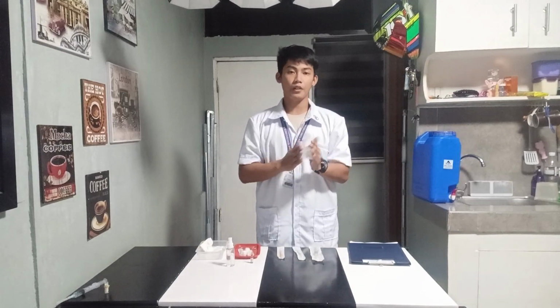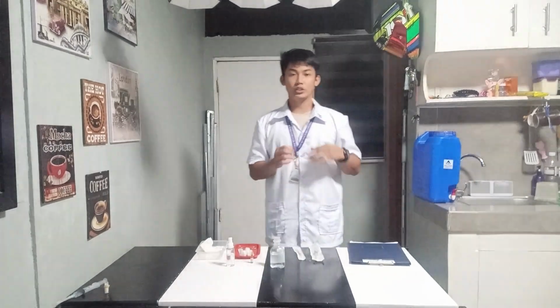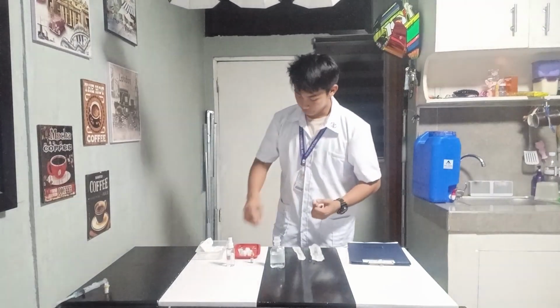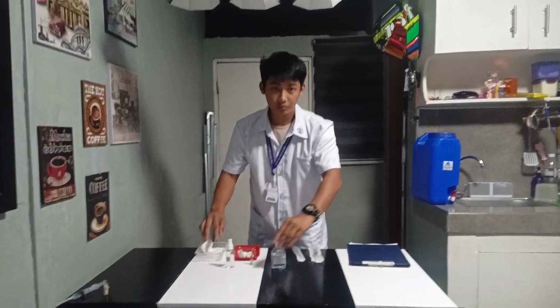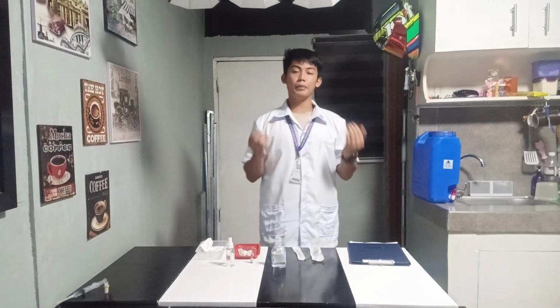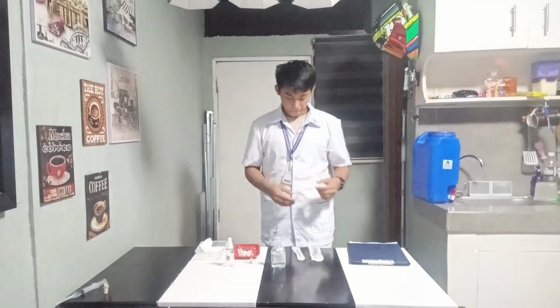Remove the protective cap, or clean the rubber cap of a previously opened vial, with an antiseptic wipe by rubbing in a circular motion to reduce the number of microorganisms. Then withdraw the medication. Attach a filter needle as agency practice dictates to draw up premixed liquid medications from multi-dose vials, and we must ensure that the needle is firmly attached to the syringe. The filter needle is helpful in order to prevent withdrawing solid particles.